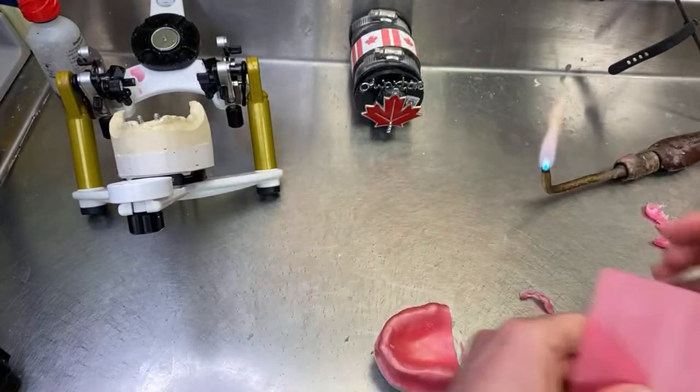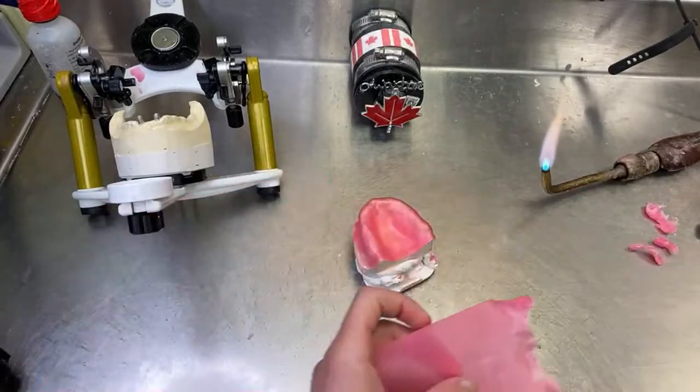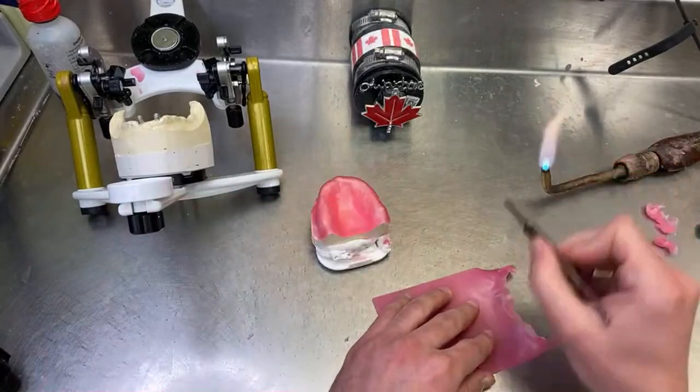Okay, so this is done. Now what I like to do is add some thickness to the base.